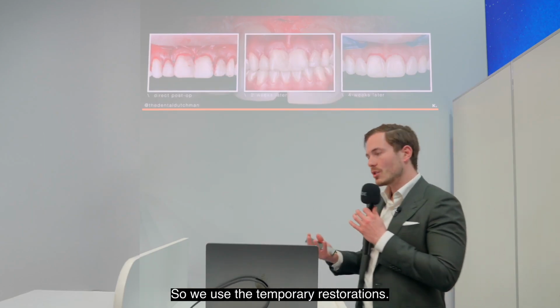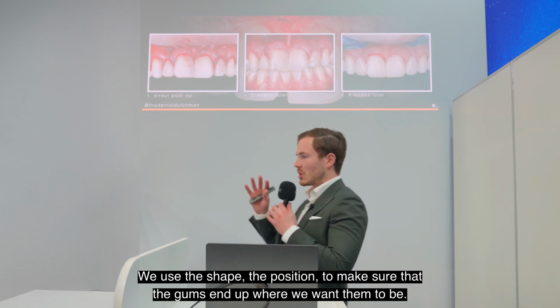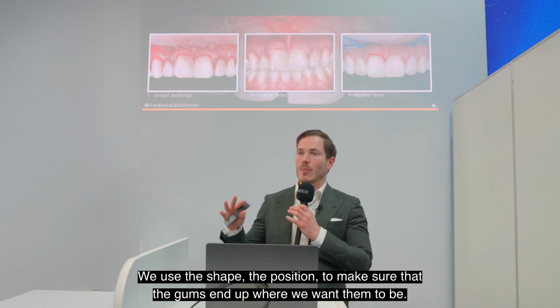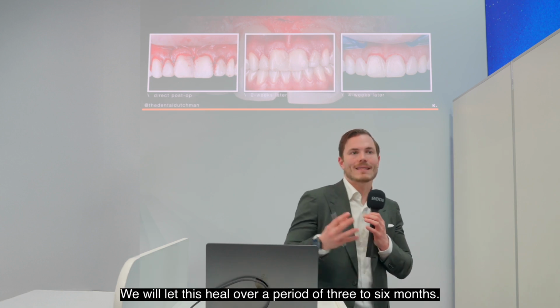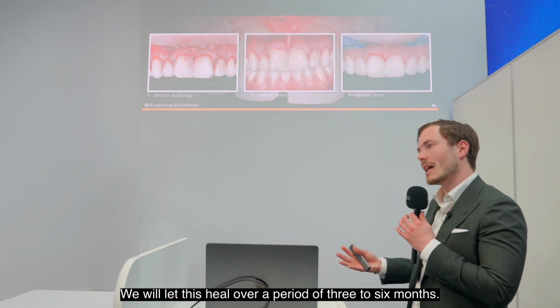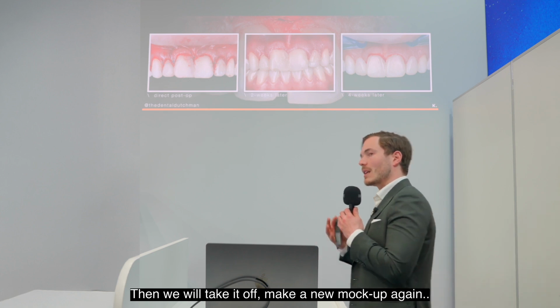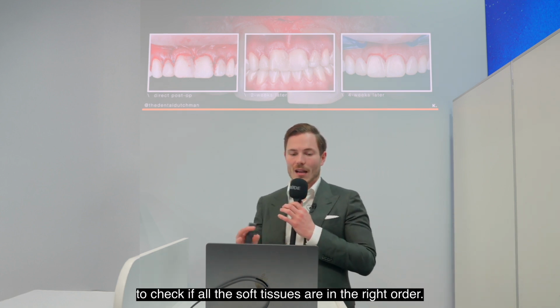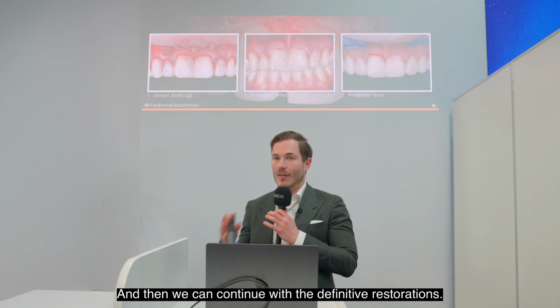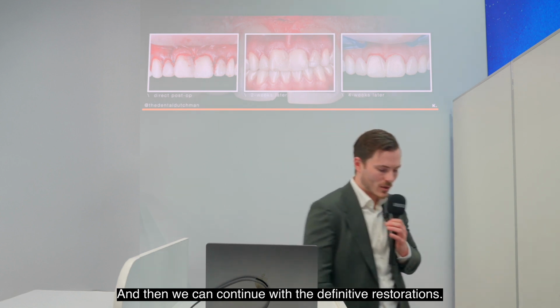So we use the temporary restorations, we use the shape, the position, to make sure that the gums end up where we want them to be. We will let this heal over a period of 3 to 6 months. Then we will take it off, make a new mock-up again to check if all the soft tissues are in the right order, and then we can continue with the definitive restorations.